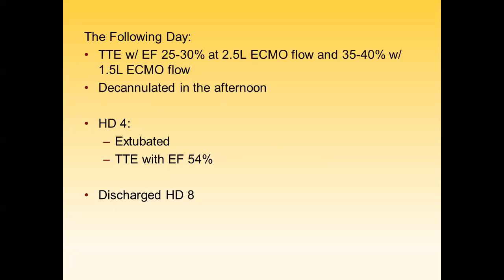So in terms of the SWAN numbers, we haven't been using them so much to get a true cardiac output, because you're right, you really can't. In many cases, you're hyperoxygenating the blood distally, and so you need correction factors for that, and the fudge factor and all that. Plus, our people get hypothermia, and so the assumptions we make for their metabolic demand are also way off. So we don't use it for a strict number. And actually, in the severe cases, or early on at least, we can usually use the flow from the ECMO as our cardiac output. At least we can use it as a low estimate, because we know we're delivering at least 4 liters. That's the lowest cardiac output they could possibly have.